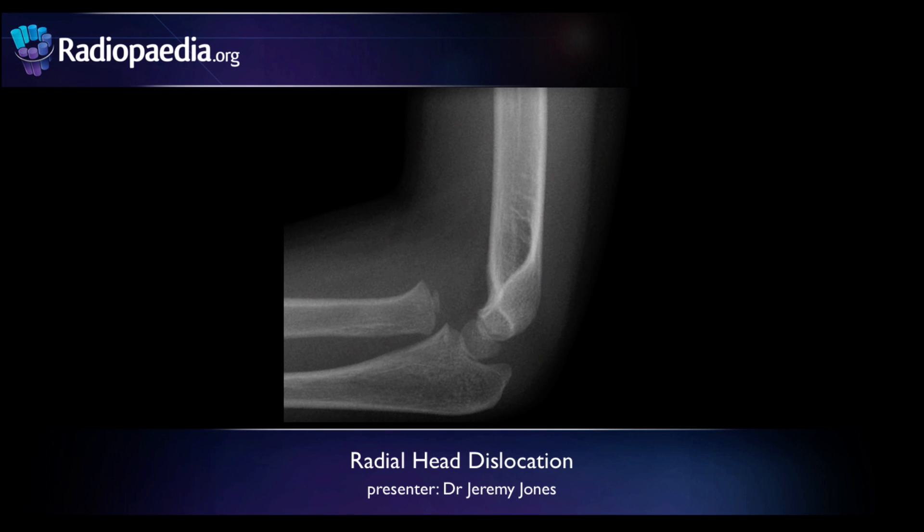This is Dr. Jeremy Jones from Radiopaedia.org and today we're going to be looking at radial head dislocation and the importance of the radiocapitellar line.